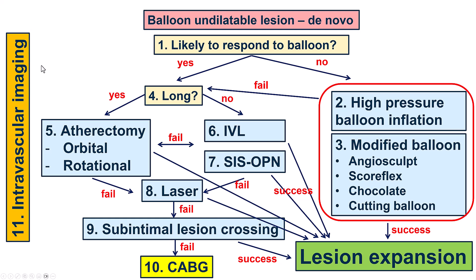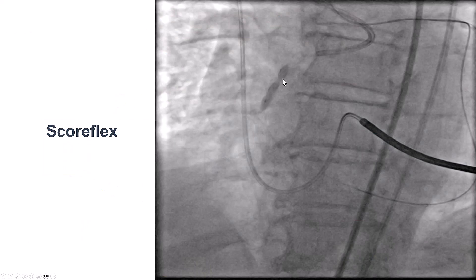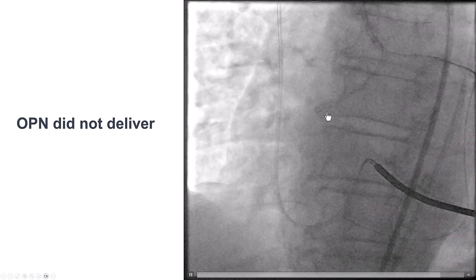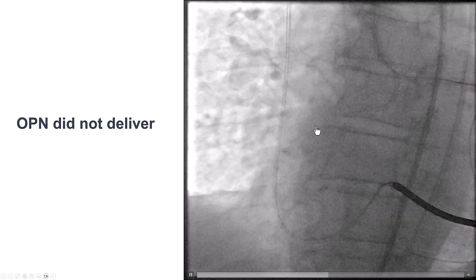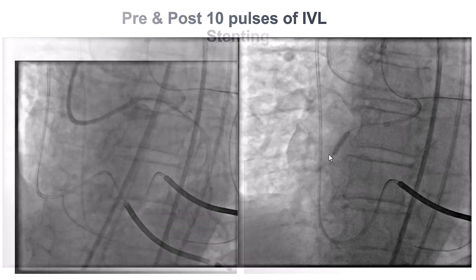Intravascular imaging is very important because sometimes it may appear that the lesion has expanded, but in reality there is still significant residual stenosis. In this case, we tried with a plaque modification balloon — a Scoreflex — but up to 26 atmospheres there was still a waist. We tried to deliver an OPN balloon but couldn't get it through the lesion. Since it was a short lesion we preferred OPN over atherectomy, especially given the extraplaque modification done further down. We were able to deliver an intravascular lithotripsy balloon, which successfully expanded the RCA lesion.